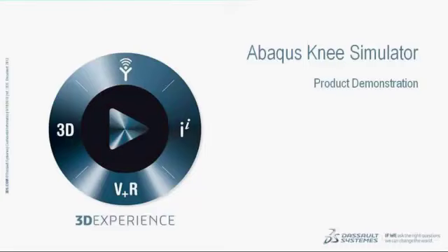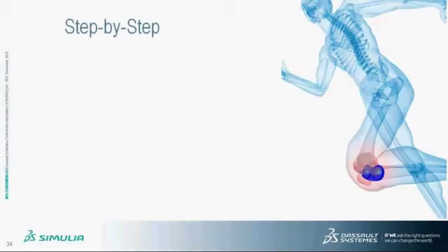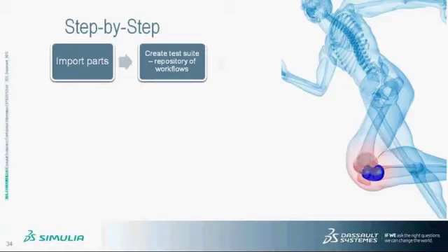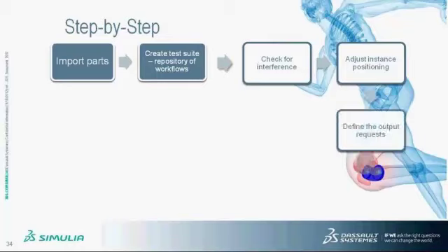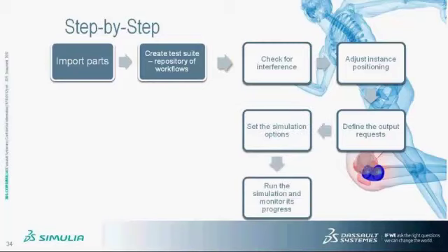So now, before we start the actual product demonstration, I just want to go through the step-by-step on using Abaqus Knee Simulator to set up these advanced knee implant evaluation workflows. First, the user imports knee implant components, then creates a test suite, which is a repository of workflows. Next, we provided tools for the user to check for interference. The reason for doing that is because the analysis is executed using Abaqus Explicit. Abaqus Explicit may run into issues if there is initial interference between the components. So we'll provide that tool to check for interference and highlight any surfaces that are having interference. Then the user is given the tools to adjust implant positioning if necessary. Then the user goes through the workflow definition that includes defining output requests, setting the simulation options, running the simulation and monitoring its progress, then visualizing the results.